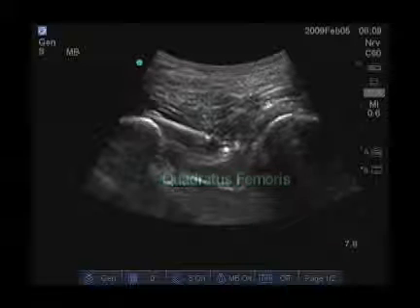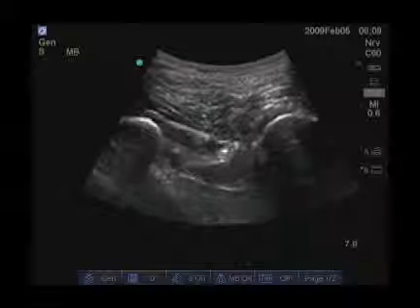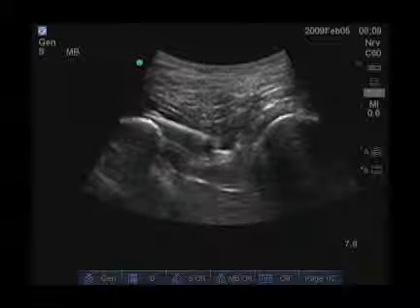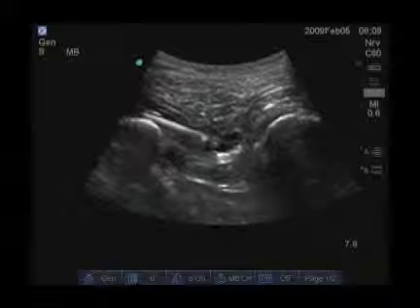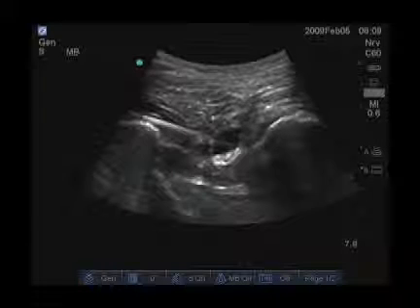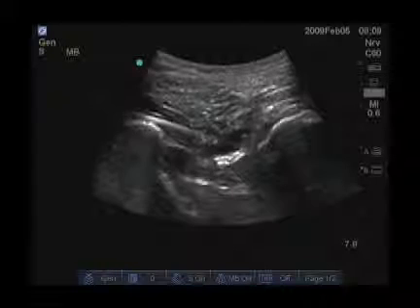Our needle is advancing above the sciatic nerve to attempt to get local anesthetic to spread to the medial side of the nerve, which would be more likely to get the larger tibial component as well as the posterior femoral cutaneous nerve of the thigh. Now you can see the nerve, which is very hyperechoic, below the local anesthetic.